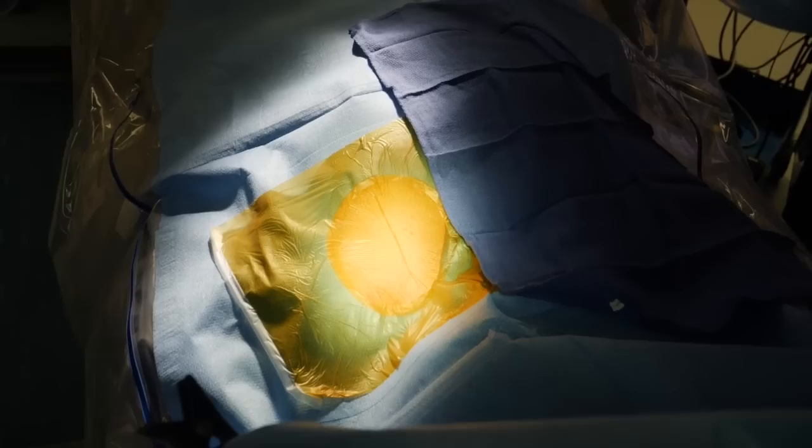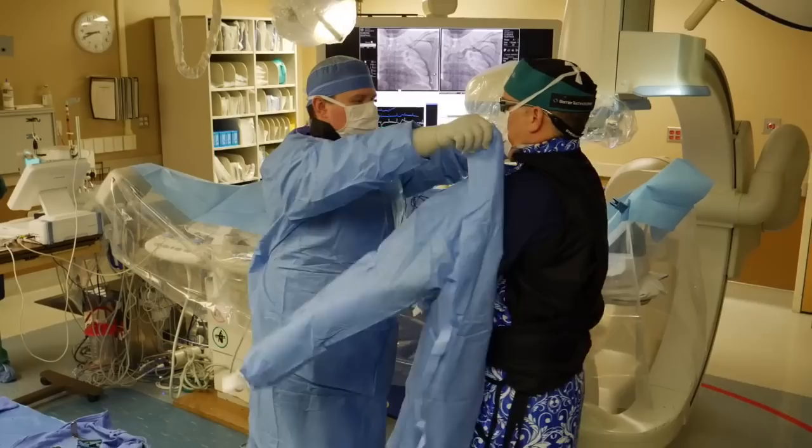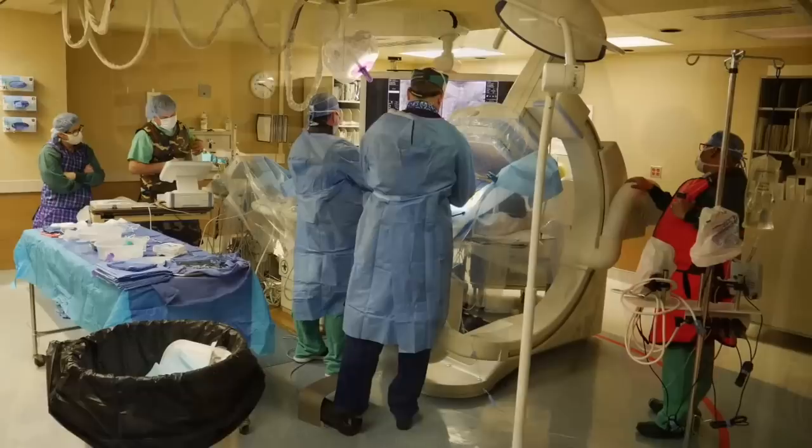Here is our setup. I come into the case, do a sterile hand scrub, get a sterile gown, and double glove to minimize the chance of infection. Here we go with the double gloves and we are ready to work.